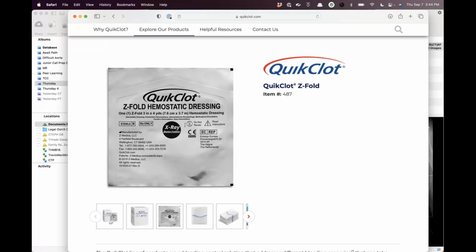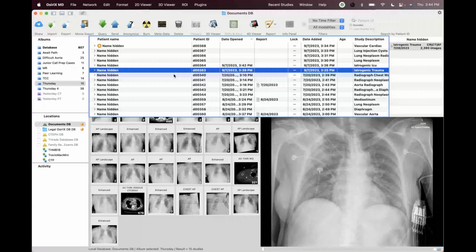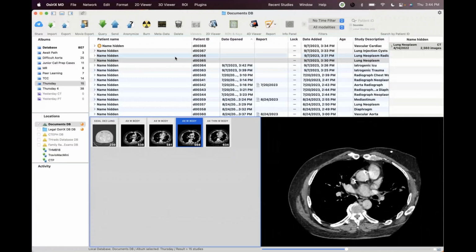Because if nobody is aware that they're cutting it, the black circle that says X-ray detectable, you could say okay, maybe. Oh, I had not noticed that until just now, that whole thing. Good pickup, Howard. Yeah, there needs to be a big asterisk right next to that. Yeah, theoretically detectable if one's looking for it. Ostensibly detectable, aspirationally. Ostensibly undetectable. That's a good point. I'm going to have to go back to that image.